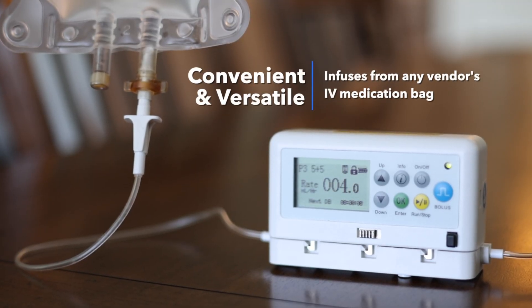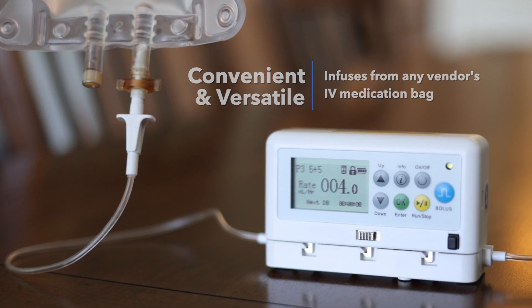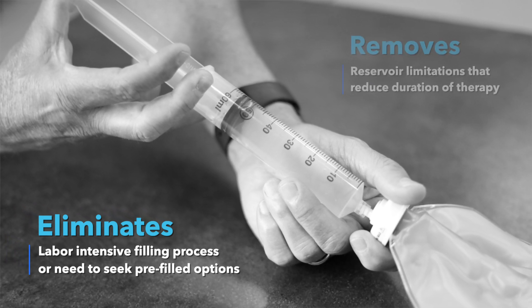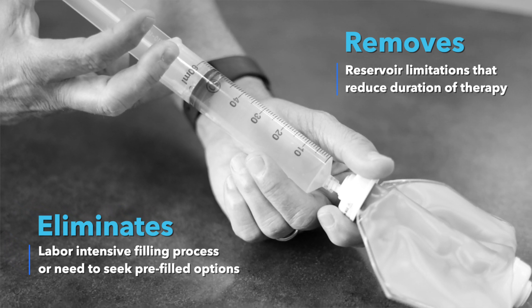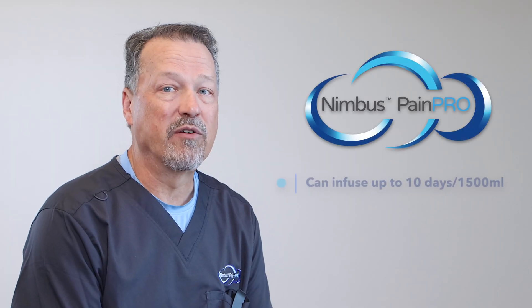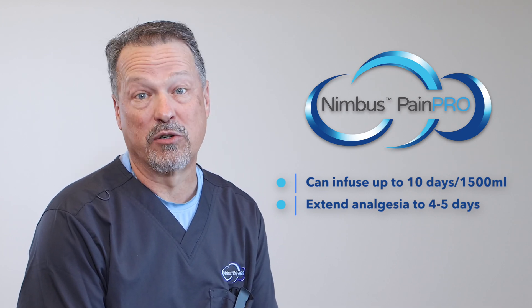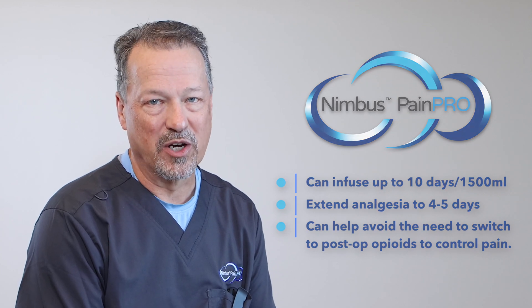The Nimbus PainPro infuses from any vendor's IV medication bag. You can say goodbye to the labor-intensive filling process that often forces a busy facility to seek pre-filled pump options. This also means the Nimbus PainPro removes any reservoir size limitations that reduce the duration of therapy. PainPro can infuse for up to 10 days or 1500 ml of anesthetic, so you can easily extend your post-op analgesia out to four or five days, avoiding the need to switch to opioids to control pain.